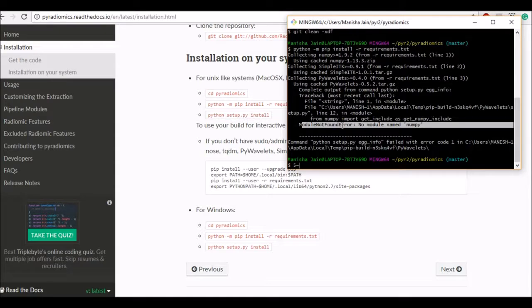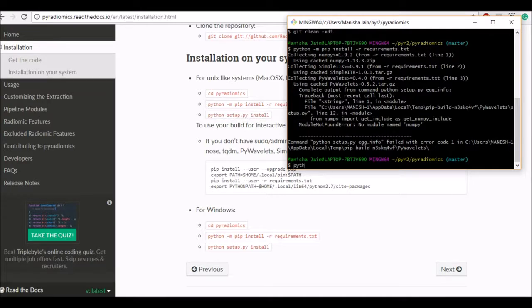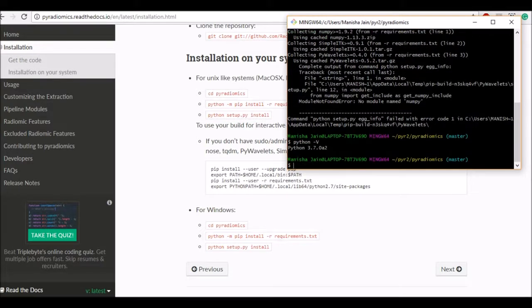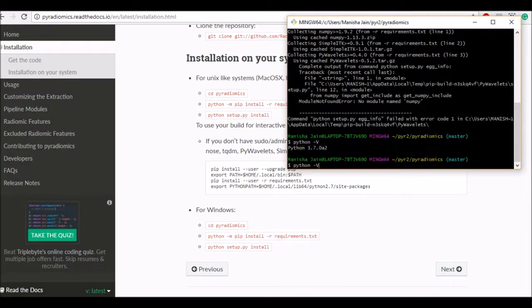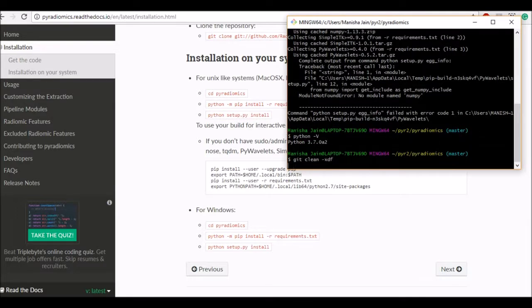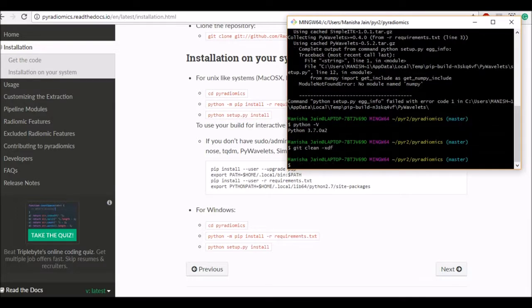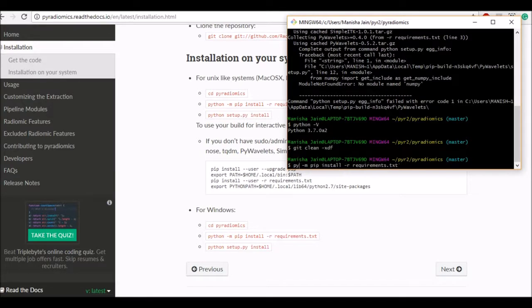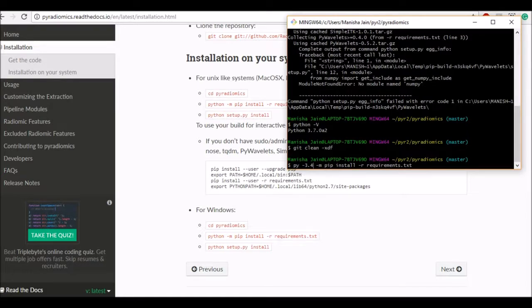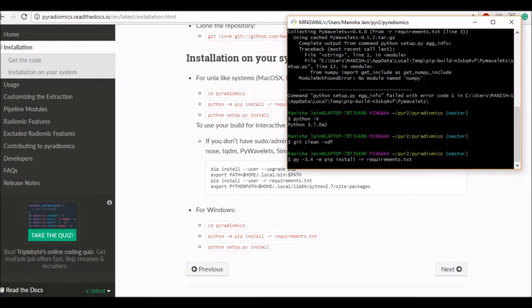So in order to fix this problem, one of the things I found is first I will check the python version so what I'm running and as you can see the problem is right there I'm running a newer version of python which is incompatible. So what we will do is we'll clean up this directory again and run with python version 3.4 which is specified, and the way to do that is you just use the command py with revision number 3.4. So after cleaning the area I'm going to rerun it and see how that goes. Again we'll come back after a few moments.